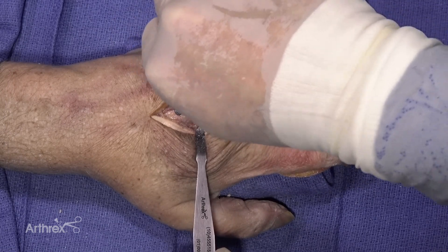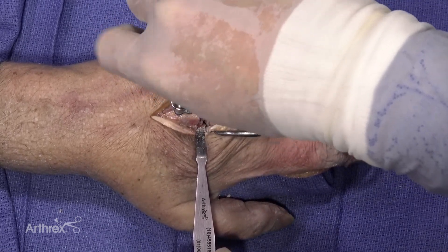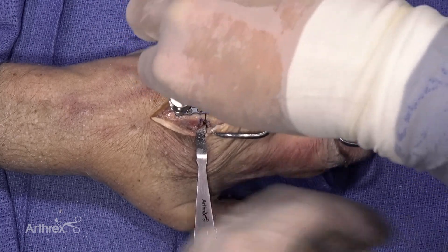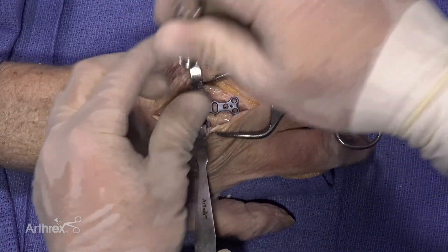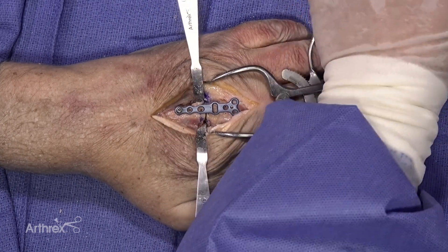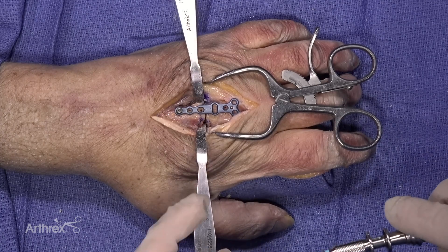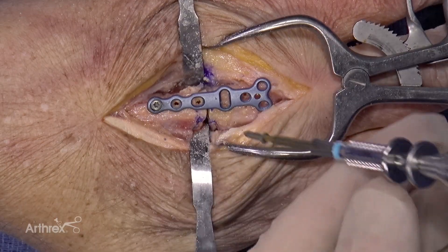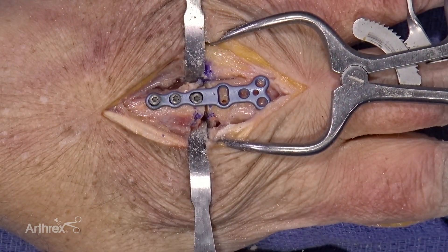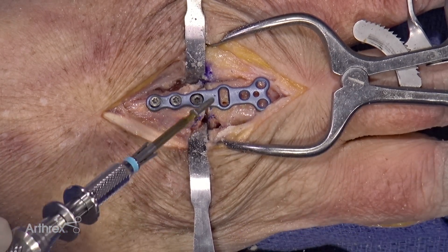Once the osteotomy is complete, the screw holes are used to realign the plate onto the bone. It is recommended that these not be taken fully down into the second cortex for complete seating until multiple screws have been placed. This allows for minuscule correction of your plate placement when reapplying to the bone. Once the plate is reapplied approximately, the distal screw hole is lined up with the radial side of the oblong hole.